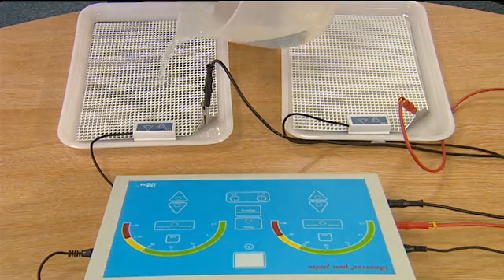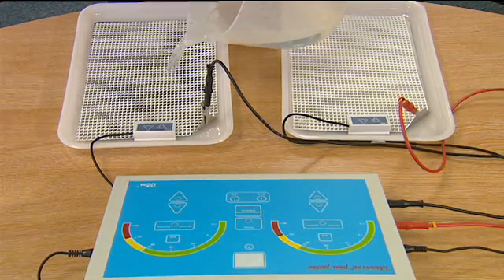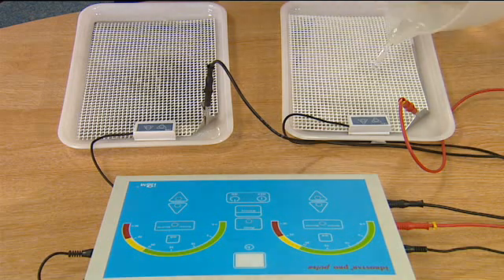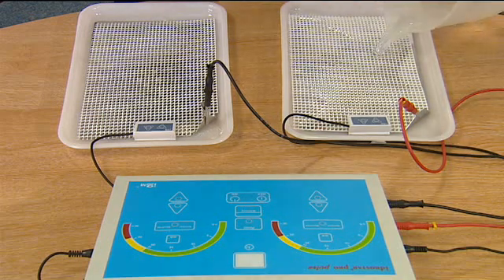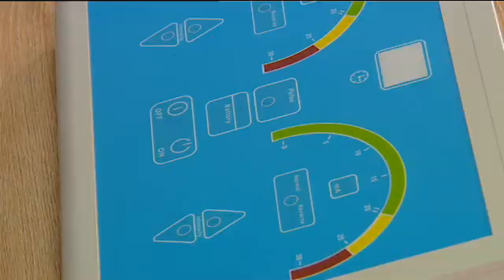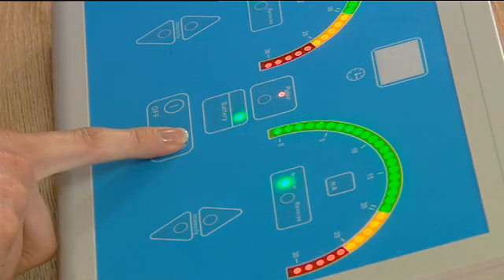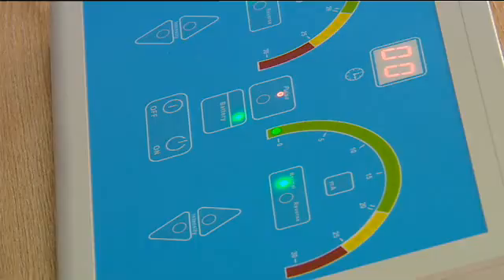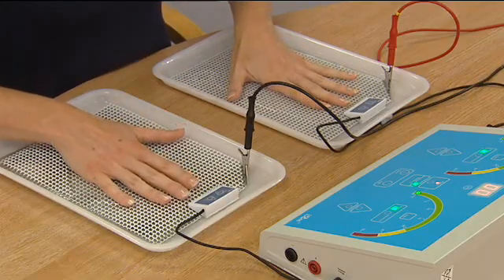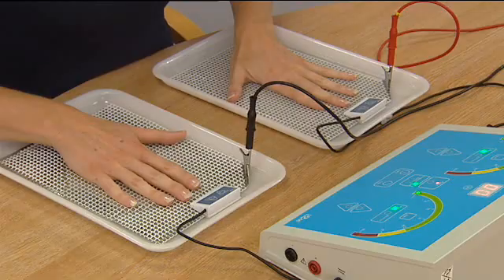Add 250ml of lukewarm tap water to each bath and turn the machine on. Place both hands into the baths, pressing lightly on the grating but avoiding all contact with the metal electrodes.